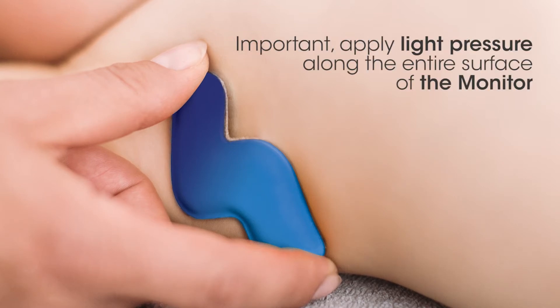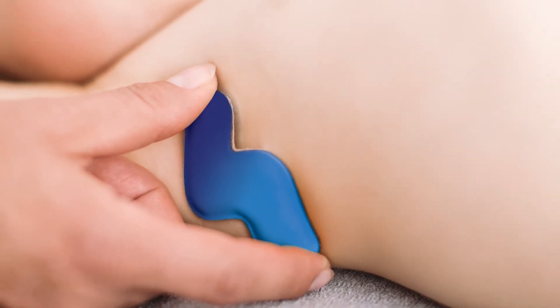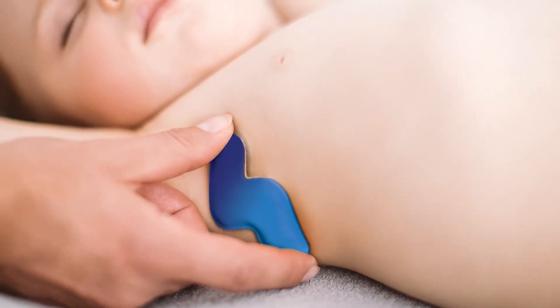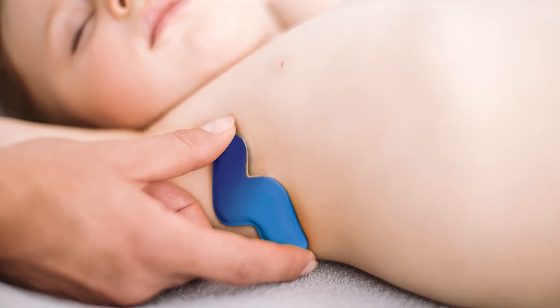Apply light pressure if needed. Don't worry — the adhesive is ultra-sensitive, making it gentle to remove. If your child wriggles or resists having the monitor put on, try applying it subtly as you lift or hold them, or make it a fun exercise by showing them their temperature.